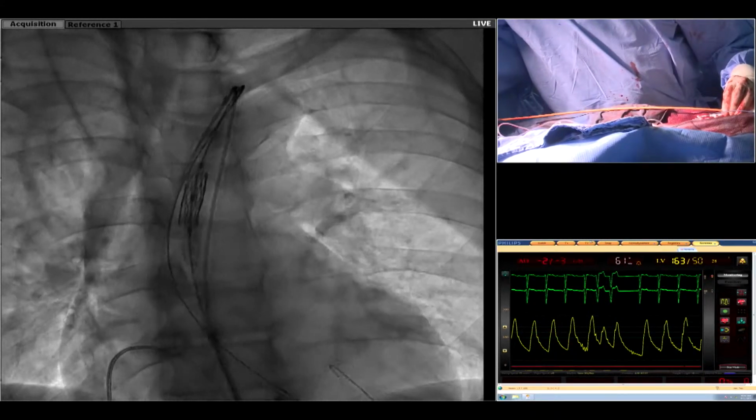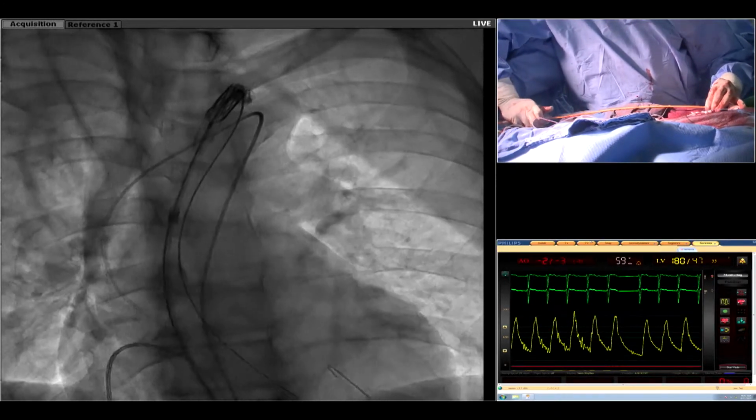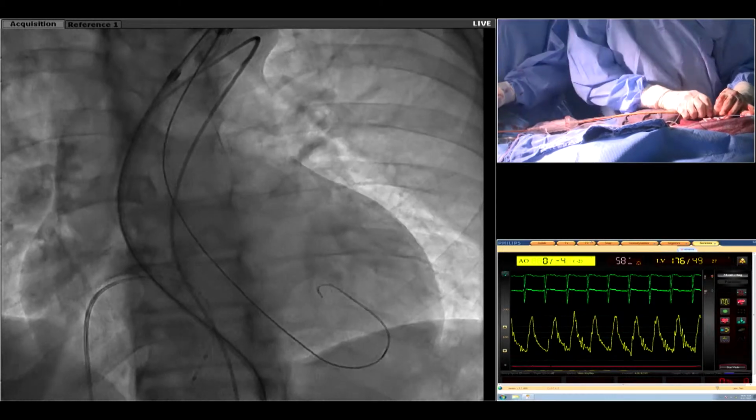We can torque it, and then it's going to come over. Show us the wire tip also. We can torque it here nicely. Show us the wire tip, please. Yeah, looks okay.